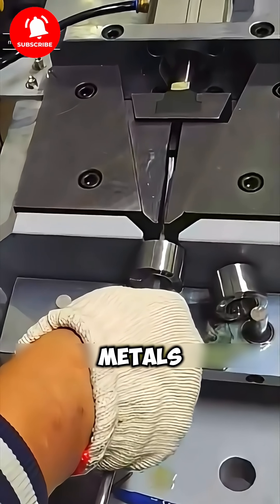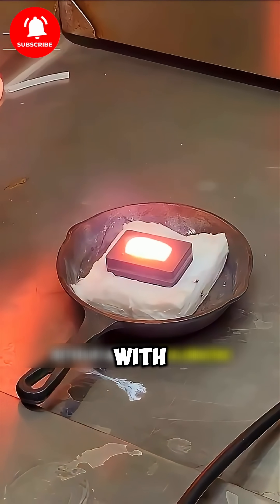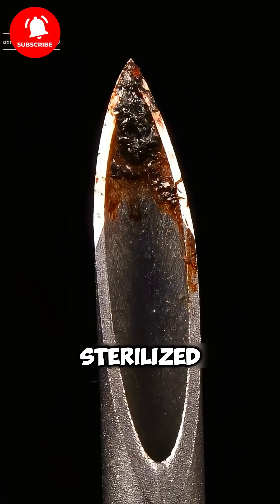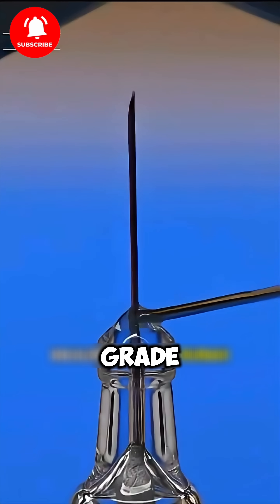But keep in mind, not all metals can be used to make syringe needles. The material has to be rust-resistant, non-reactive with body fluids, sharp, hypoallergenic, and able to be sterilized without damage. One example is stainless steel, 316L medical grade.